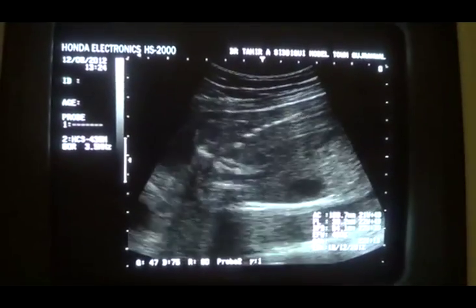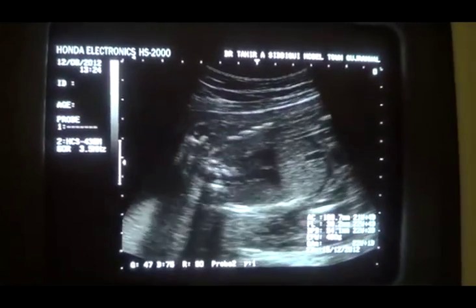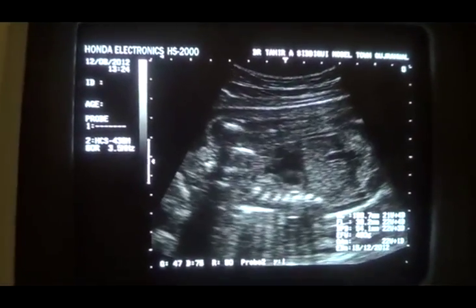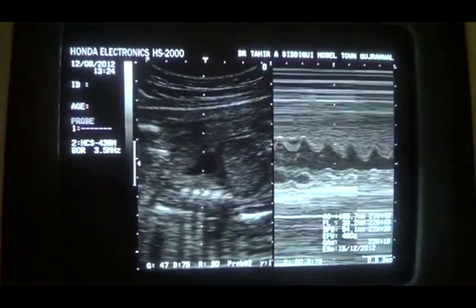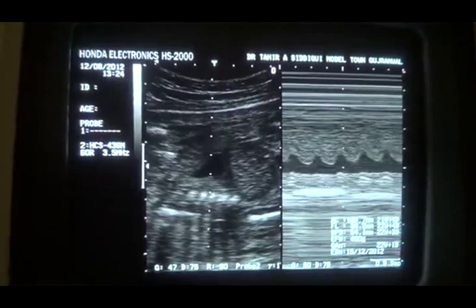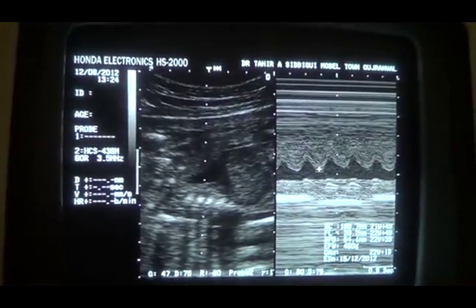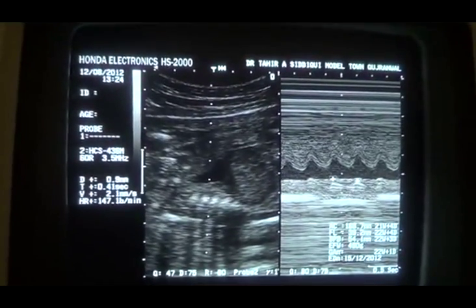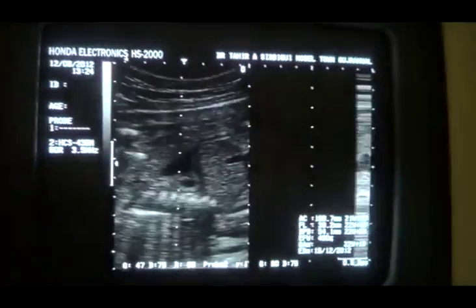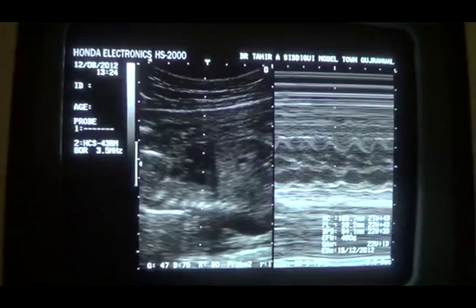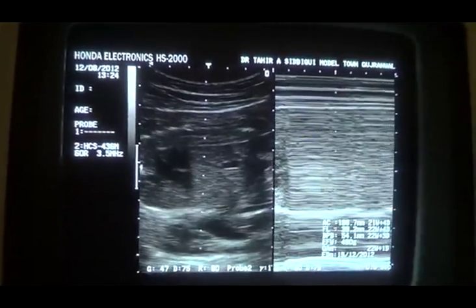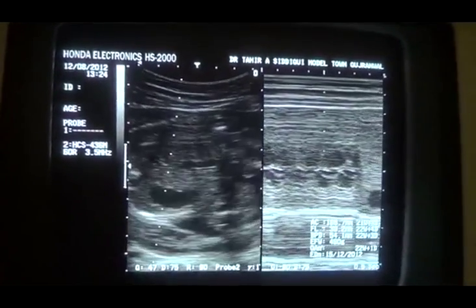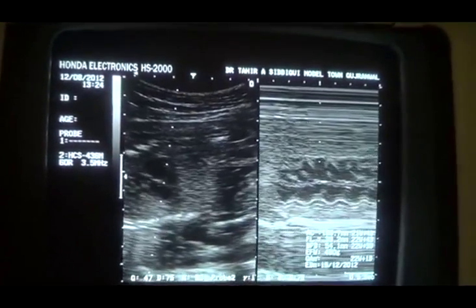The patient has a bad obstetric history — a bad cervical history. The cardiac activity at this point is 147 to 150 beats per minute. Let's wait for some time and see if there is any variation and if possible we will be able to see the respiration in the same view.